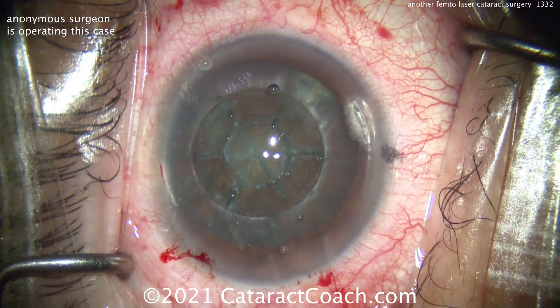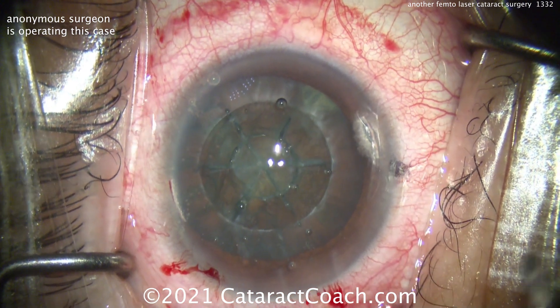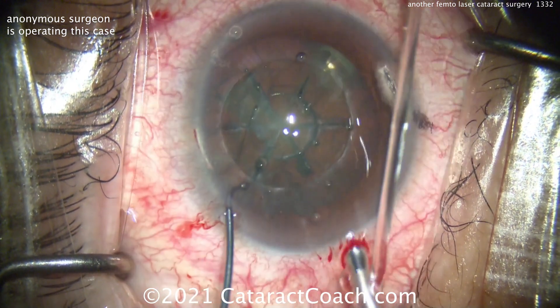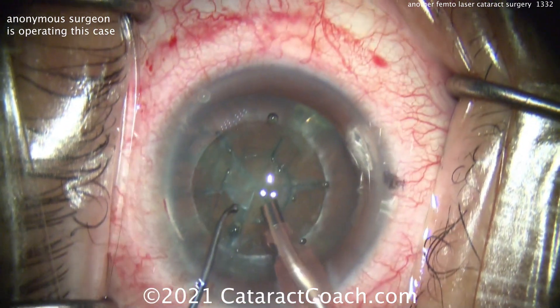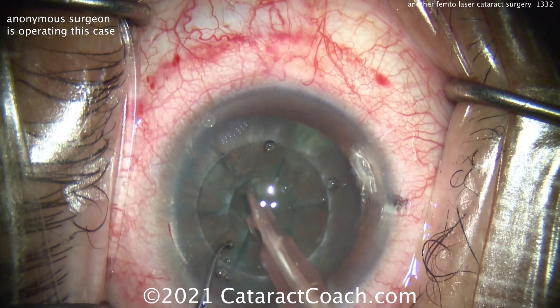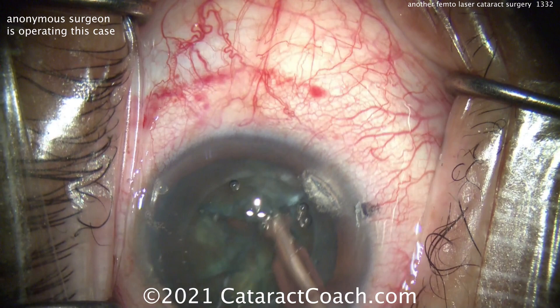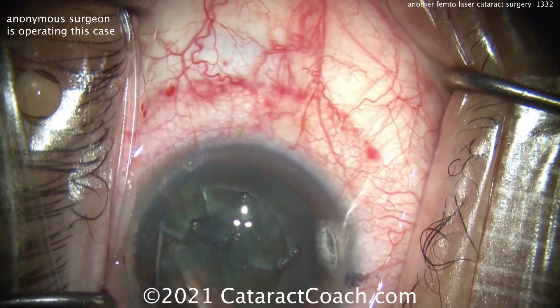And so now going inside the eye, a little more viscoelastic — time to remove the nucleus. Here's the phaco probe going inside the eye. It looks like a ball-tip chopper. You don't really need a sharp chopper anymore if you've already broken up the nucleus. So now this surgeon is going to go inside and looks like still doing a stop-and-chop, sculpting a little bit of a central groove and then doing it along those fault lines that were created so it's really easy to split the nucleus.